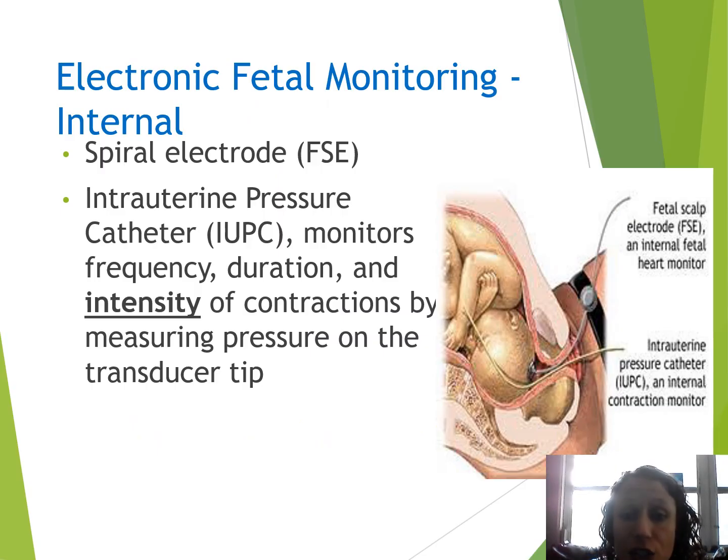This is the internal fetal monitors. So we have internal monitors. They are considered invasive. Their membranes have to be broken for this to be placed. So they would have to be at least somewhat dilated for it to even be placed. There is some evidence that can show the fetal scalp electrode, that's the FSE, that's the one that goes on top of the baby's head. It really just breaks the layer of skin. So that's one of the reasons why we also consider it invasive. So it increases baby's risk of developing an infection because it's just broken the skin barrier.